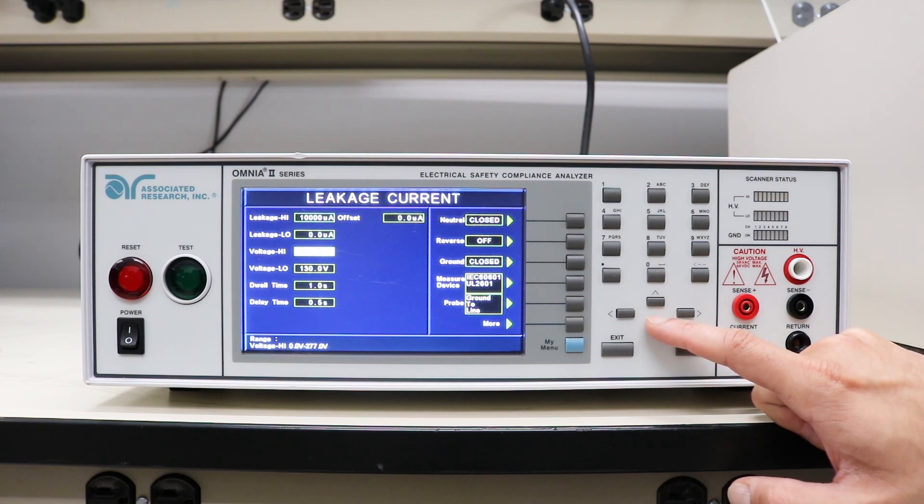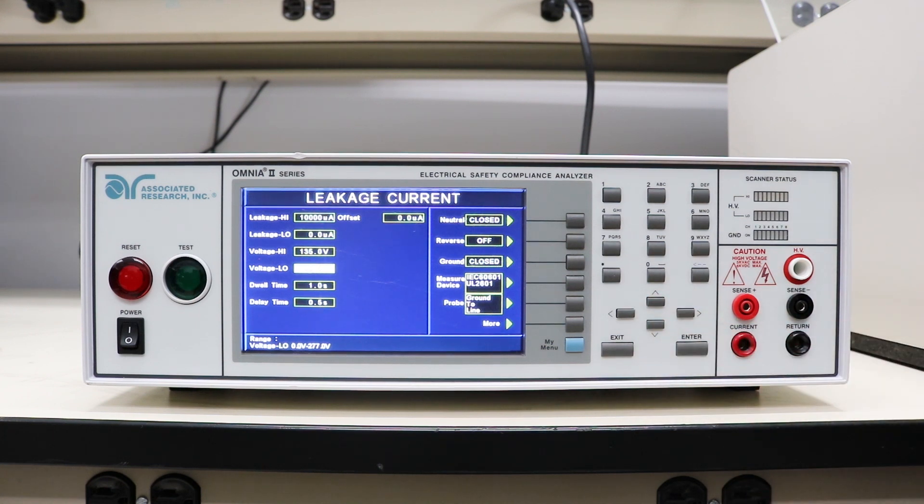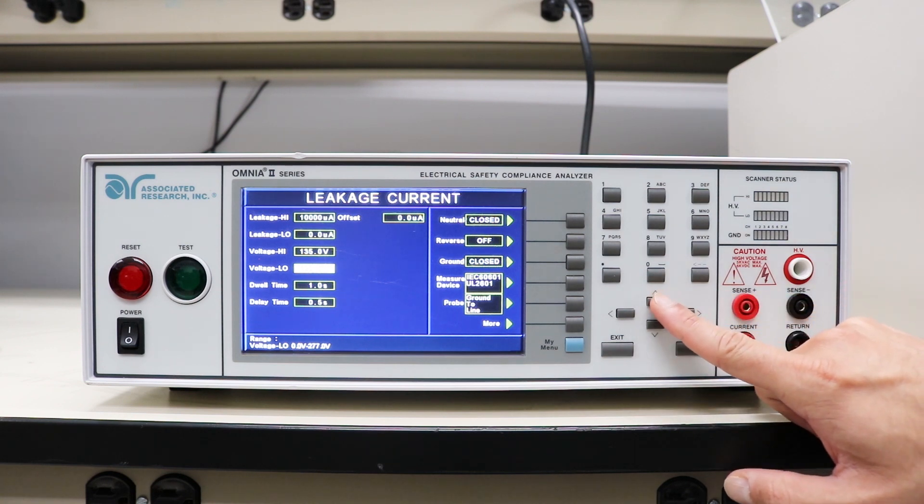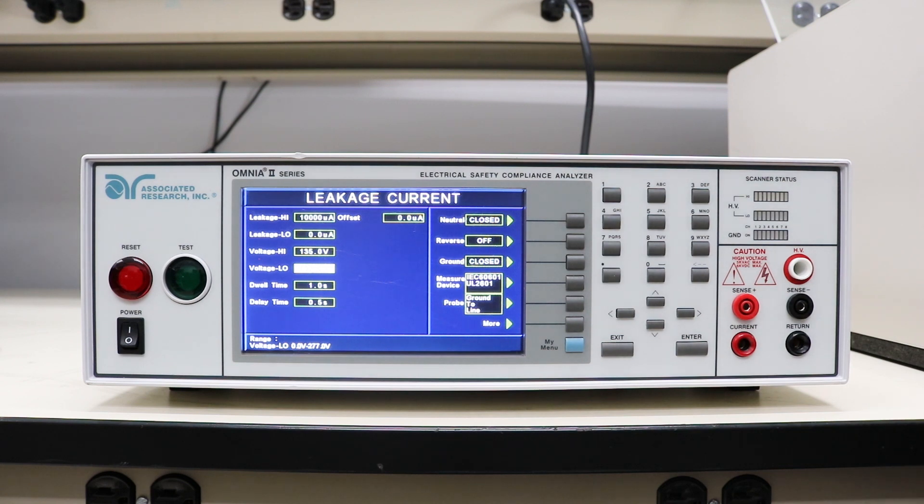Then we have voltage high and voltage low. We will be powering up our device using a programmable AC source that's built into this safety analyzer, and it's set to output 132 volts, which is 110 percent of the rated line voltage of this device. We have our voltage high at 135 and voltage low at 130 to make sure that the voltage does not change too much.